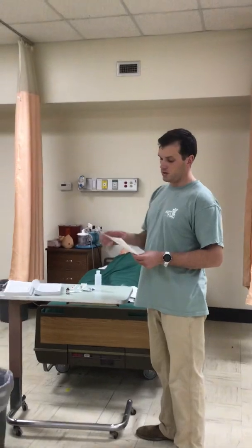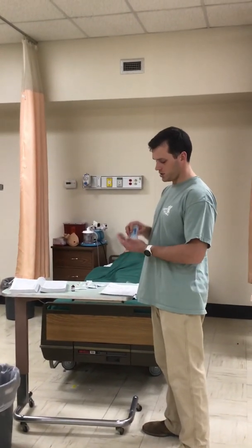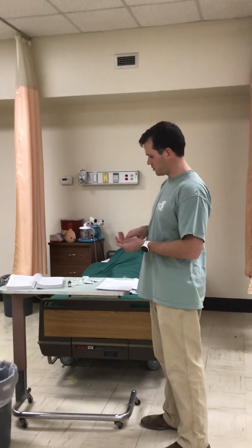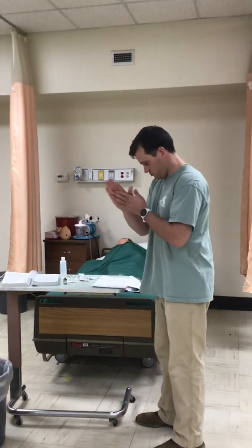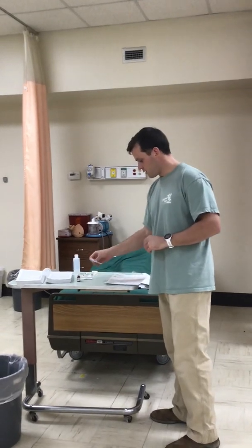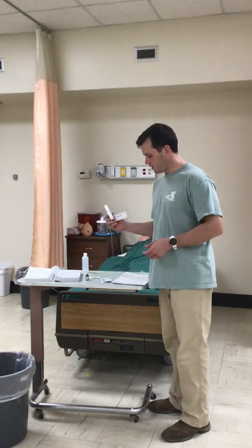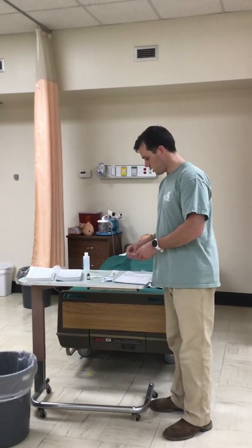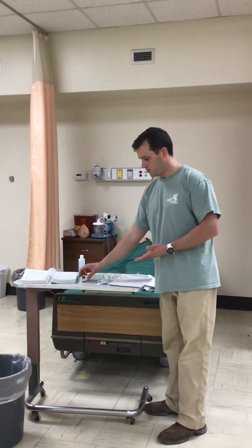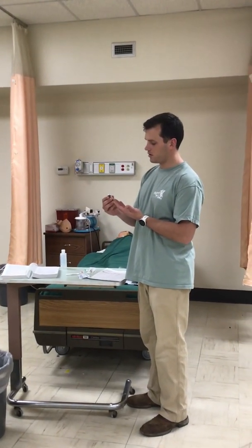I have checked to make sure that this is the right medication for the correct patient once already. Preparing my medication and my equipment, I'm going to perform hand hygiene. I'm going to make sure I have alcohol pads, a syringe, a blunt needle, and of course my label and my medication, which at this time I'm going to check to make sure is not expired.